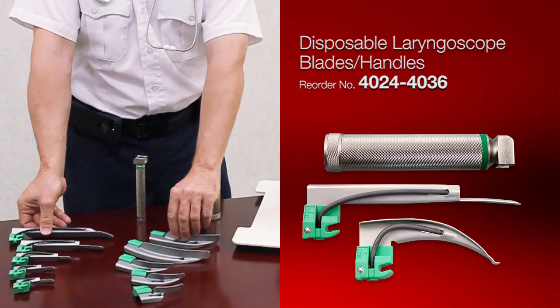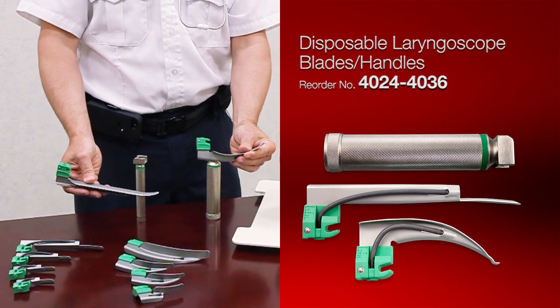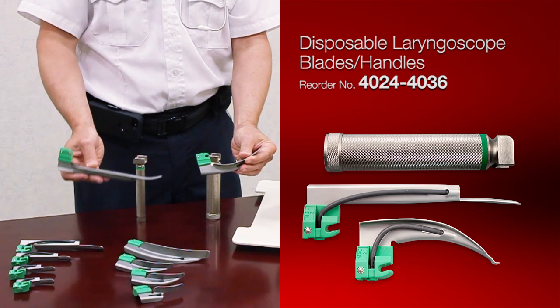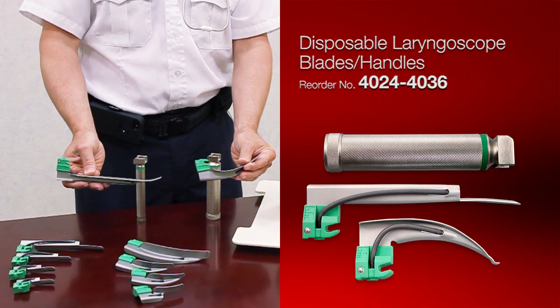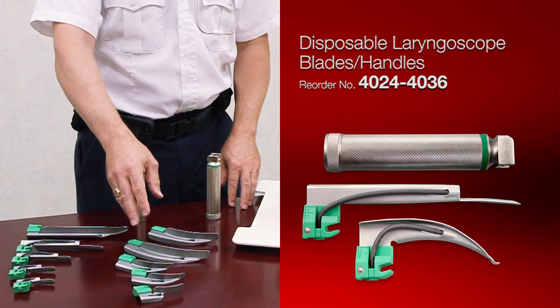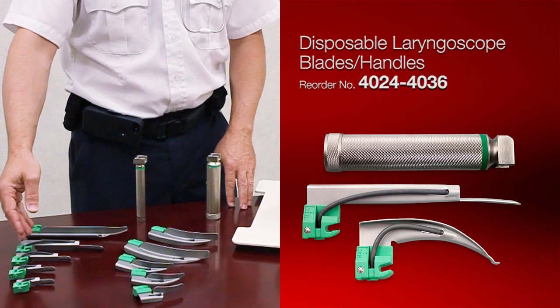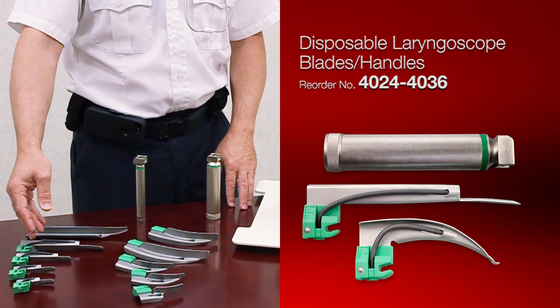You're going to have two different blade styles and sizes. One style is curved and that's a Macintosh. The other style is straight and that's called a Miller. They come in different sizes — the Macintoshes come from a zero up to a four, and the Millers come from a double-zero up to a four.